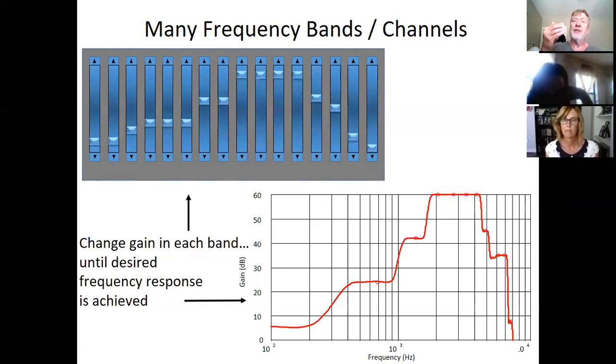As we move on in this course, we'll talk about how compression is used in digital hearing aids. We'll talk about digital noise reduction for at least a unit. We'll talk about directional microphones in another unit. We'll talk about automatic feedback reduction in another unit. So we're going to be covering all of that. That's why this course is called Compression and Digital Features.